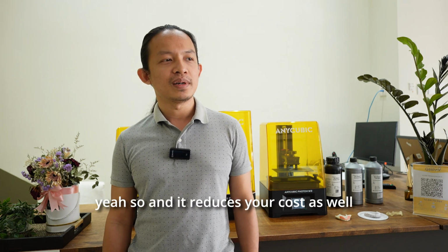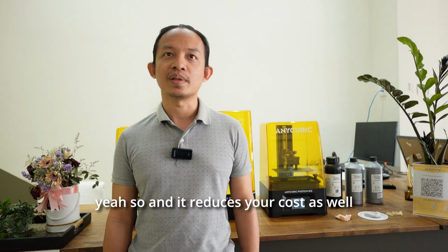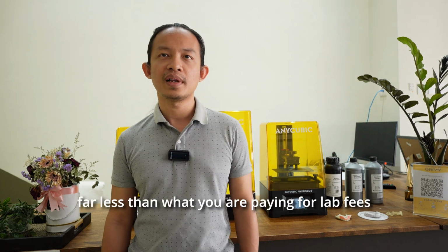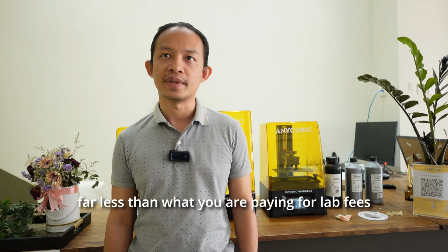Yeah, and it reduces your cost as well because the material is not cheap, but you don't use so much, and the overall cost is far less than what you are paying for lab fees.